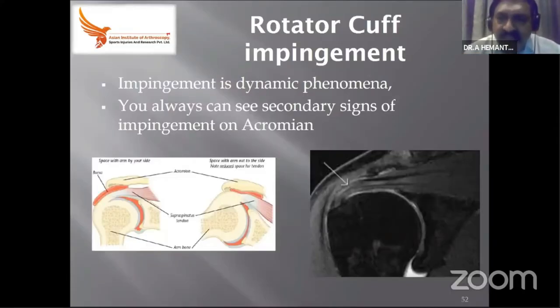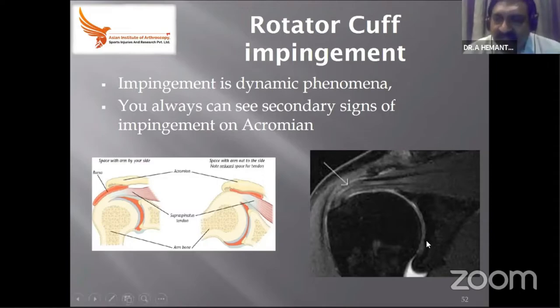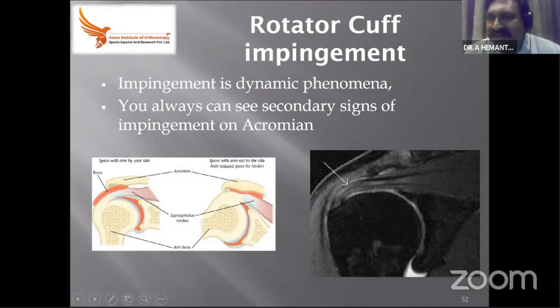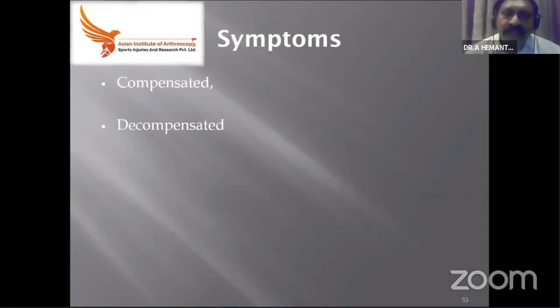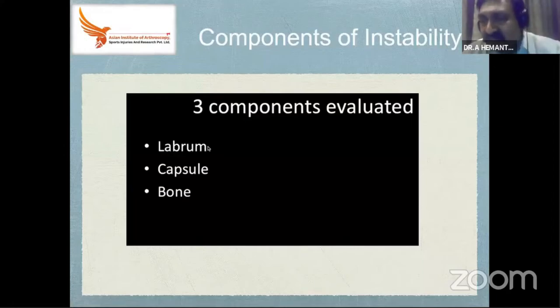The most common question involves impingement — the acromion impinging on the humeral head. On MRI we see a delaminated tendon and an impingement sign from the acromion. We normally see secondary signs of impingement; since MRI is not dynamic, we should not be too enthusiastic to say impingement is seen — rather say secondary signs of impingement are seen. The shoulder may be compensated or decompensated. Even though we see a lot of tears, they may not all present clinically, due to compensation by deltoid and pectoralis major.